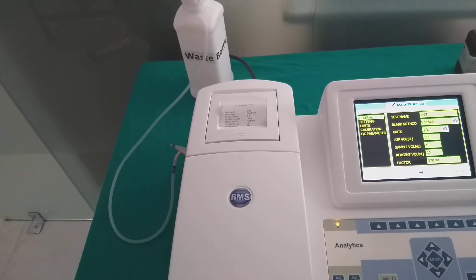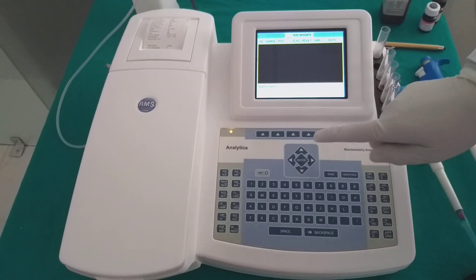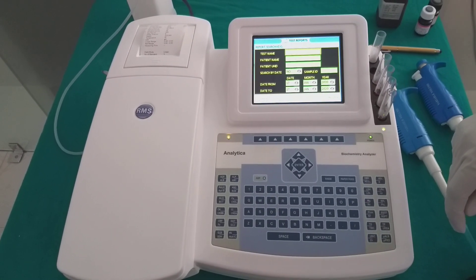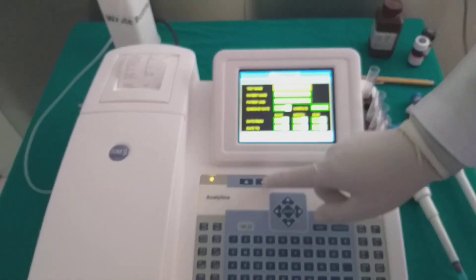In-built 2-inch graphical printer for multi-form report printing. Analytica has 100,000 test results memory and reports can be retrieved by date, patient ID, search date, and with fuzzy search.